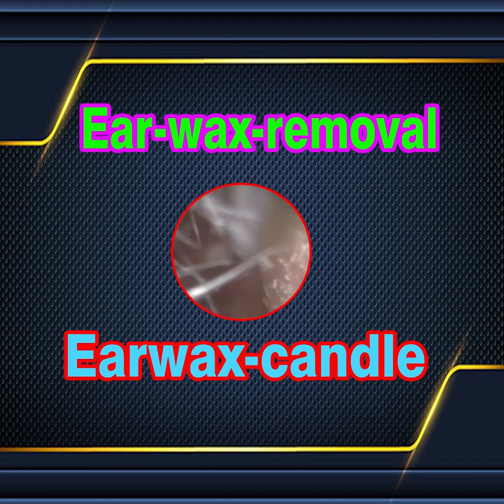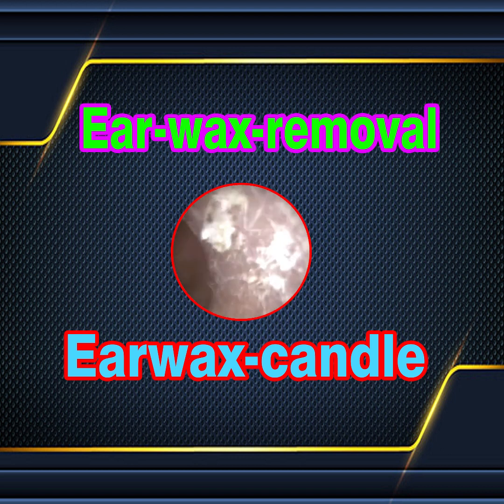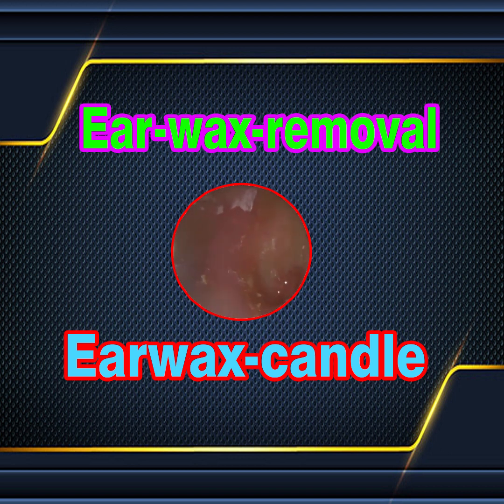I had a patient, I'll try and upload the video. It's a short video, in fact it was a non-procedural video. It's a diagnostic video. It's a patient who attended with serous otitis media, another name for middle ear effusion, so there's fluid buildup. So I see the colour here of the skin. I thought there was some coating, but it's not. It's just a bit darker there, so there could be a bit of inflammation there possibly.